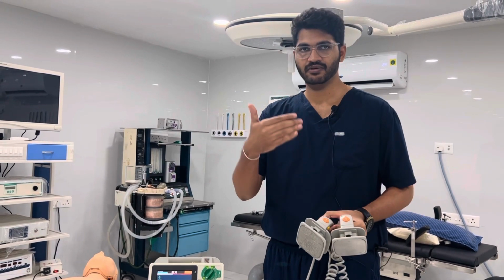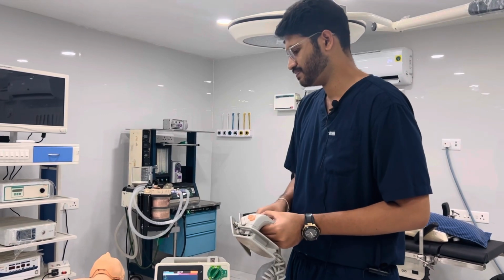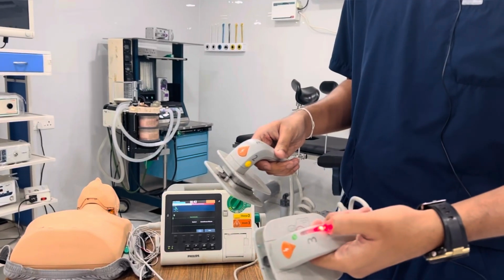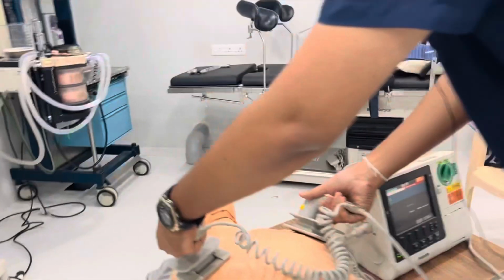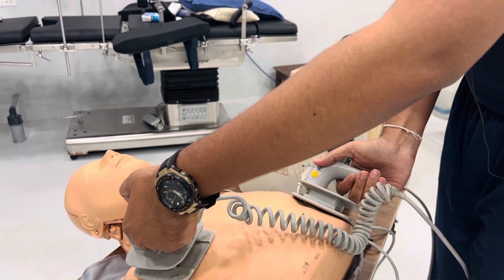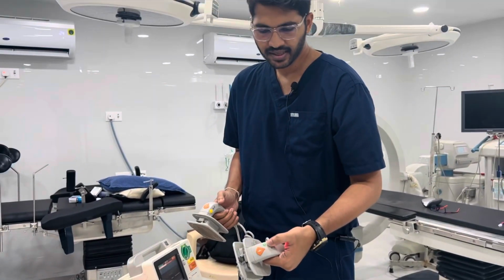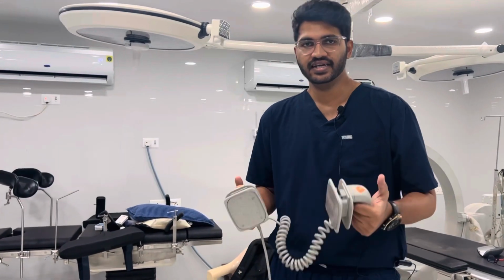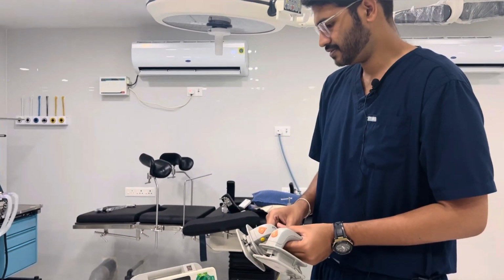As we discussed before, to get consent, you have to explain the high risk to the patient's attenders as well. And what do you see in the color of these paddles? Now it is showing red. If you keep the paddles on the mannequin, it will show the proper color. The color goes from red to yellow to green. When the color rises up to the tick mark, it means the paddle contact is adequate, and the entire paddle surface is on the patient's body surface. That's what it denotes.